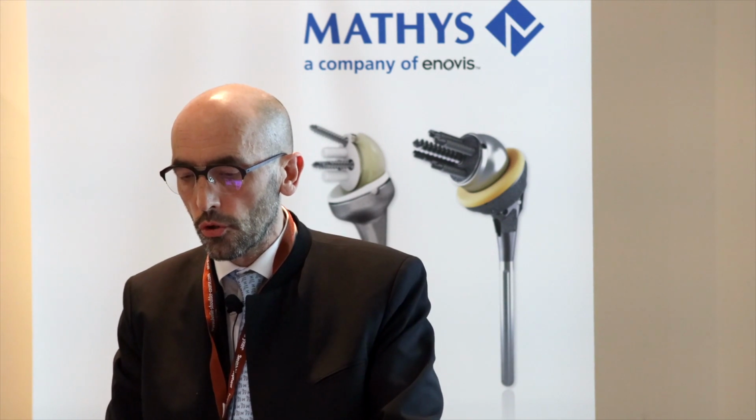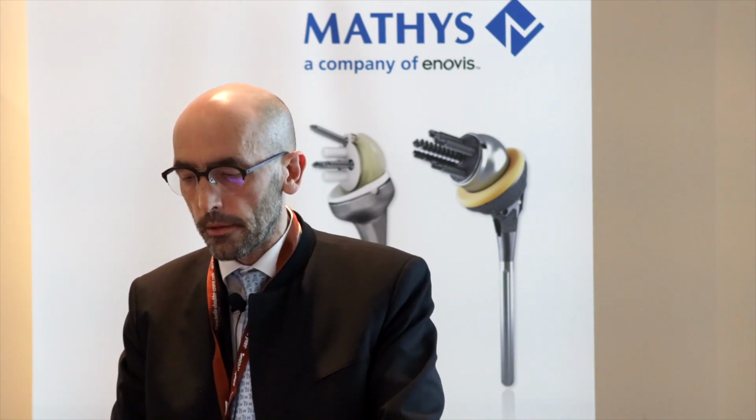And if you look at the biomechanical studies, you can see that when you have a 2/3 sphere, as you can see here, from a biomechanical point of view, it's very, very good. Even if you lateralize with the bone here, you still have some problem, as I said, with the inferior part of your graft, which is not the case with the 2/3 sphere. And furthermore, if you look at the muscular balance, if you use a 2/3 sphere, it's better.